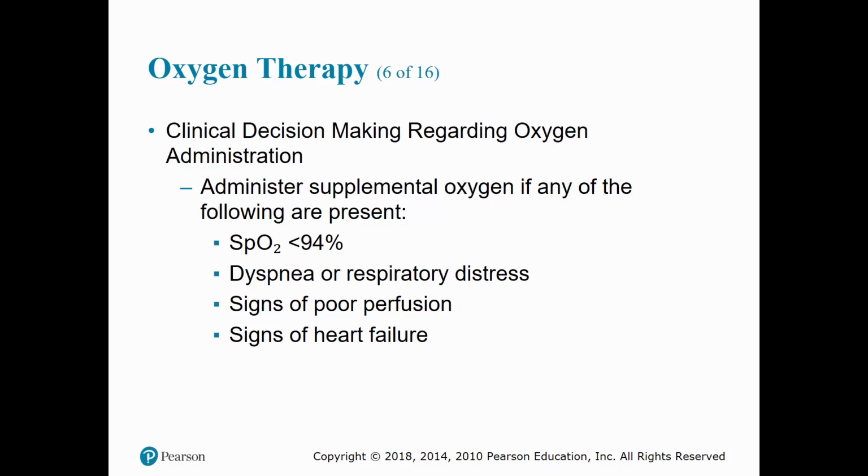In these cases, a nasal cannula, not a non-rebreather, will be applied, starting with a liter flow of 2 liters per minute and titrated upward based on the patient's response to the oxygen therapy. It is no longer deemed appropriate to provide oxygen by a non-rebreather at 15 liters per minute in an attempt to maximize oxygen concentration in arterial blood. It has also been discovered that the improvement of arterial blood oxygenation via the use of a nasal cannula at 2 to 6 liters per minute is much greater than was thought in the past.